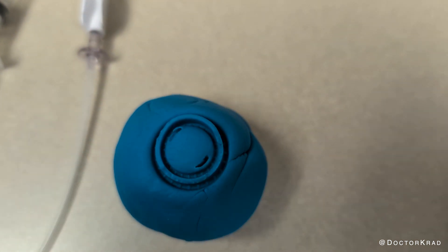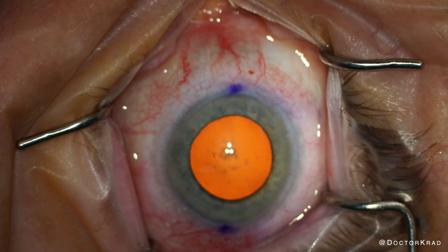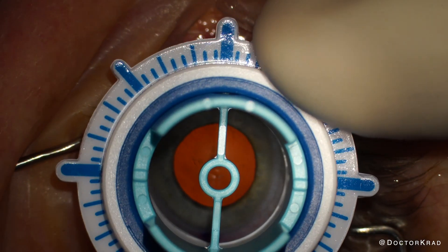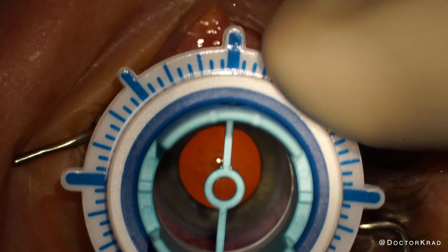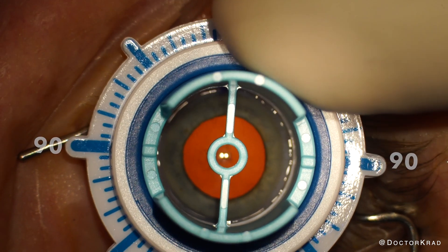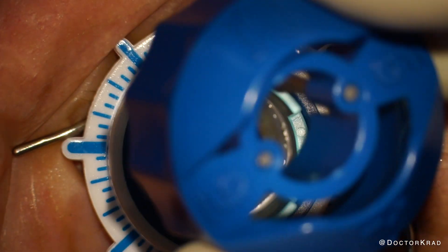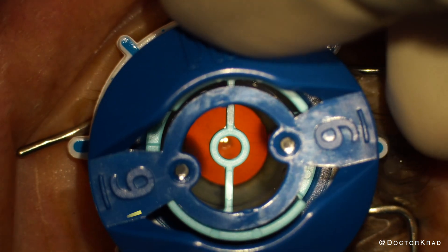Here you can see this Play-Doh eyeball that I tried it on. You'll want to mark the eye in pre-op. Here I mark the eye at 3 and 9 o'clock, and then place the colored template you desire inside the suction ring and align it with your axis of treatment. In this case, I'm using the light blue template, which is for a 30 degree arcuate. I aligned it at 90 degrees for my treatment, and then asked my scrub tech to apply suction with the included syringe. As suction is confirmed, I use the 9mm optical zone blades.